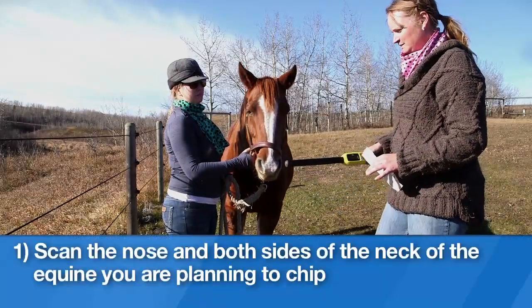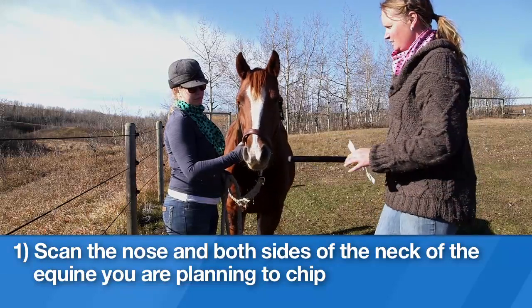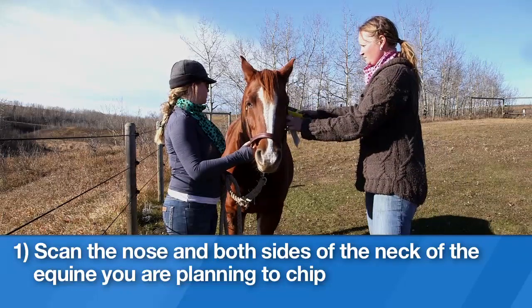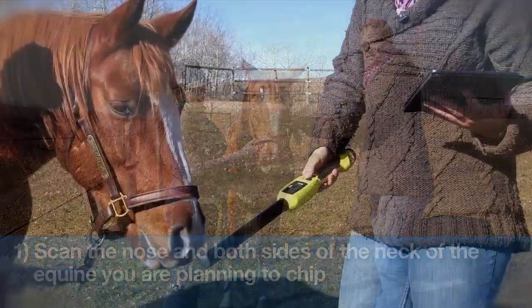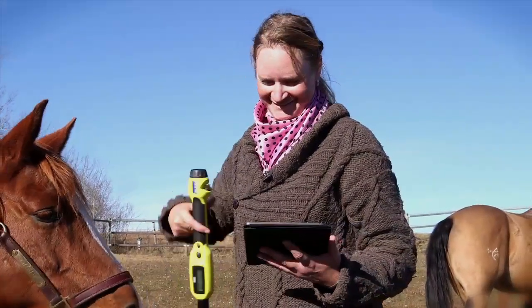1. Scan the nose and both sides of the neck of the equine you are planning to chip. Equines may already have a microchip in their nose or neck. Never assume that an equine does not have a microchip. If a horse does have a microchip, make note of its location and number.